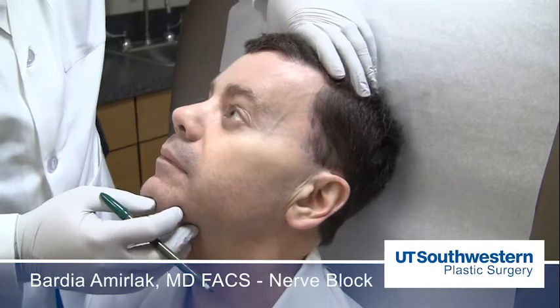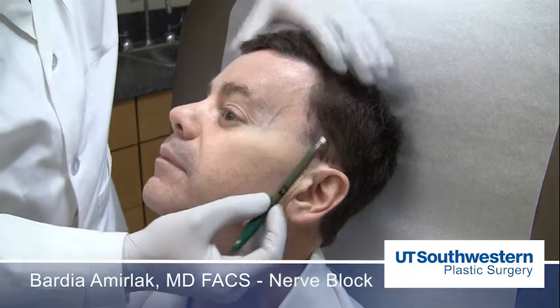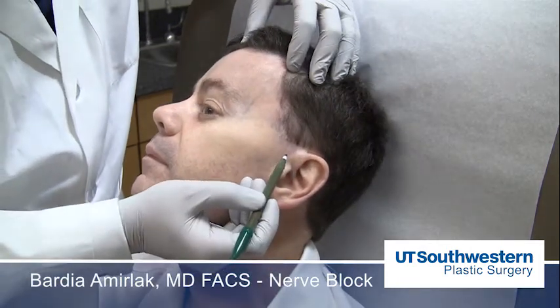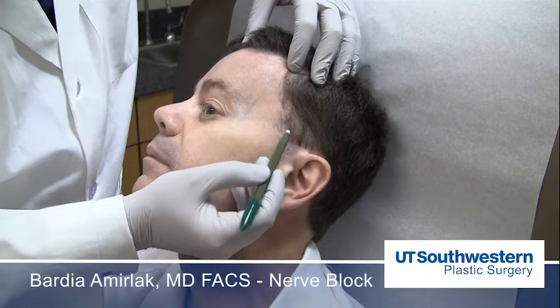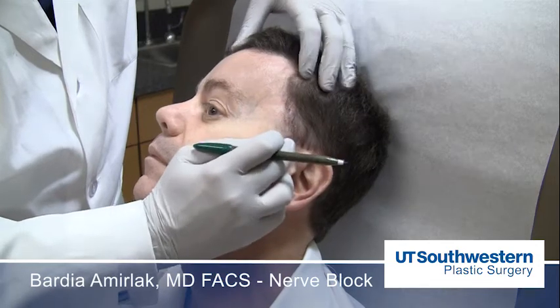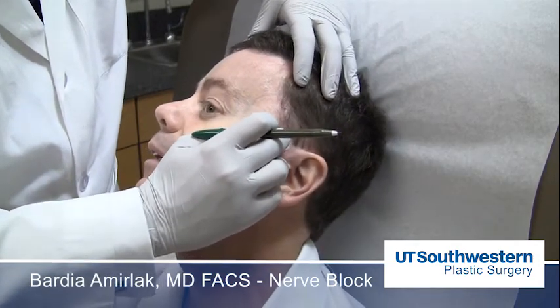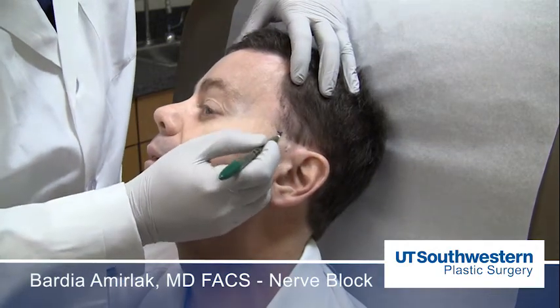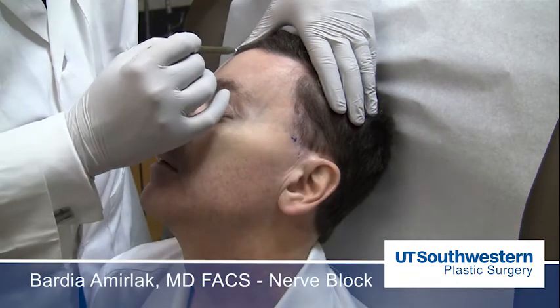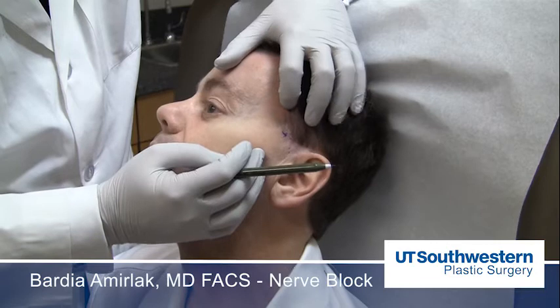For the total nerve block of the forehead and the temple, you have to address the auriculotemporal nerve, which starts from here and gets compressed right above the TMJ. And also where it crosses the anterior branch of the temporal artery, approximately 10 centimeters from the midline — this is usually at the hairline.